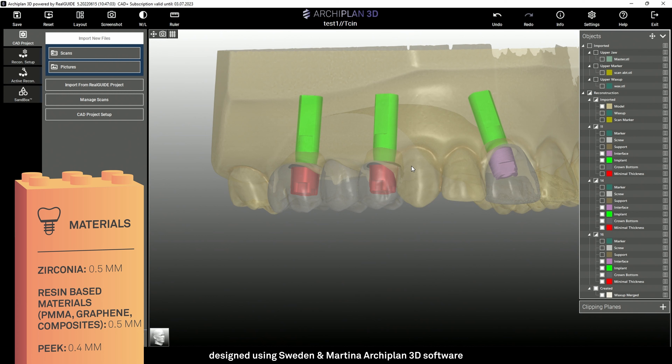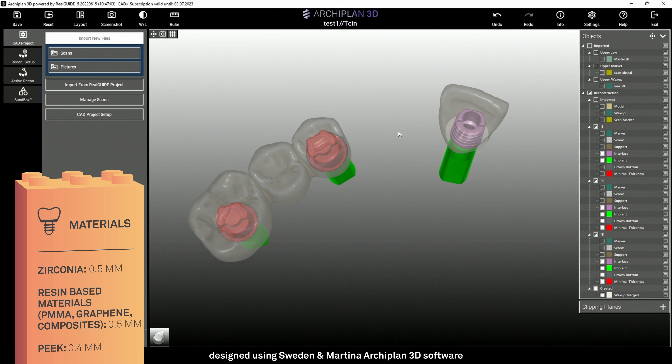The recommended minimum thickness depends on the material chosen. For zirconium, it's 0.5 mm. For resin-based materials such as PMMA, graphene, and composites, it is also 0.5 mm. For PEEK and metals, we can go down to 0.4 mm. It is possible to use your own personalized parameters, taking care to always respect the recommended minimum thickness.